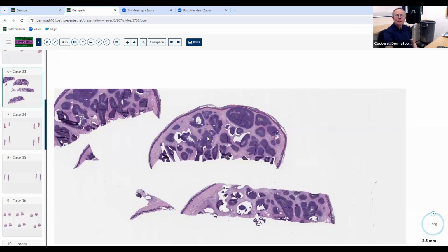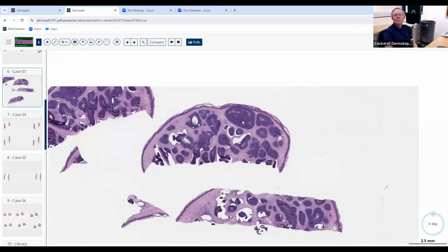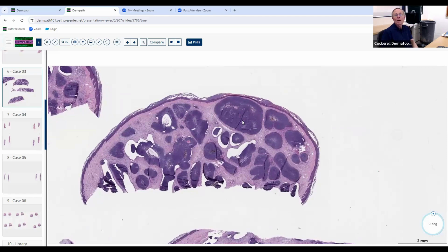So we say, well, what things are blue in the skin at low magnification? You think of things like lymphoid, neuroendocrine. Probably the most common is germinative epithelium, basaloid epithelium, especially of the follicle. Of course, we know that the most common cancer of man is basal cell carcinoma, which is a neoplasm that's recapitulating follicular differentiation. So the most common of the blue lesions that we see in dermatopathology are basal cell carcinomas or basaloid lesions, or follicular-based lesions.